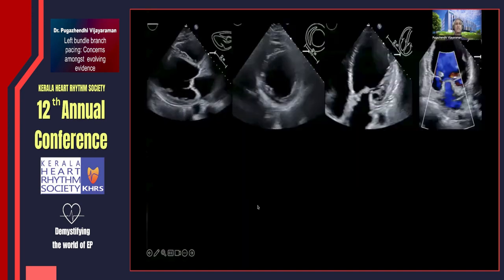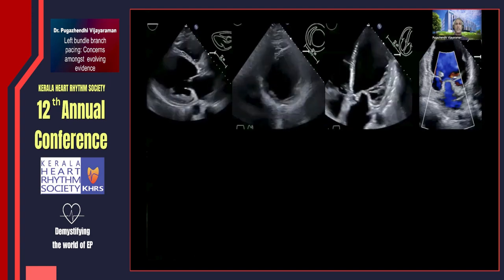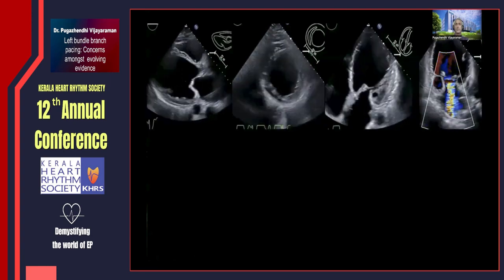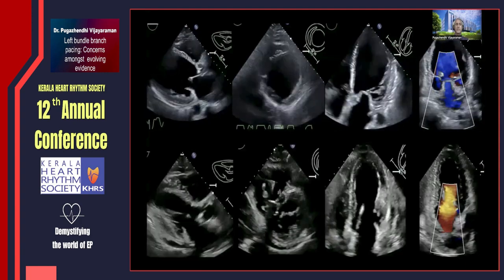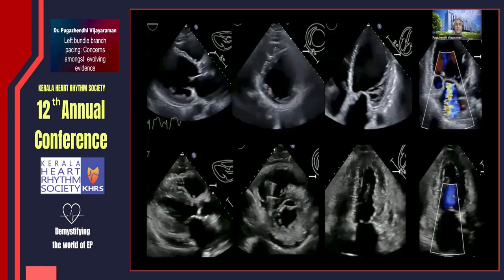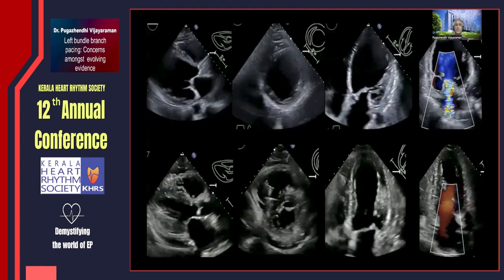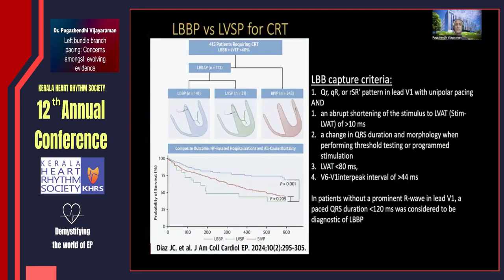Look at the echocardiogram: severely dilated LV and fairly wide, dysfunctional, dyssynchronous LV. And this is within 3 months after LOT-CRT. LV function normalized and EF completely improved. So in this patient, the combined approach clearly helped in terms of maximizing electrical resynchronization.